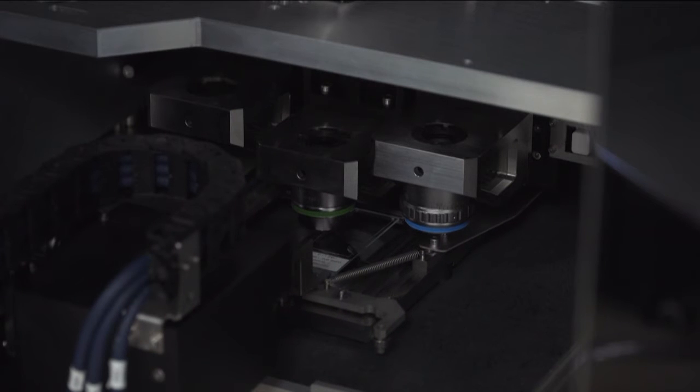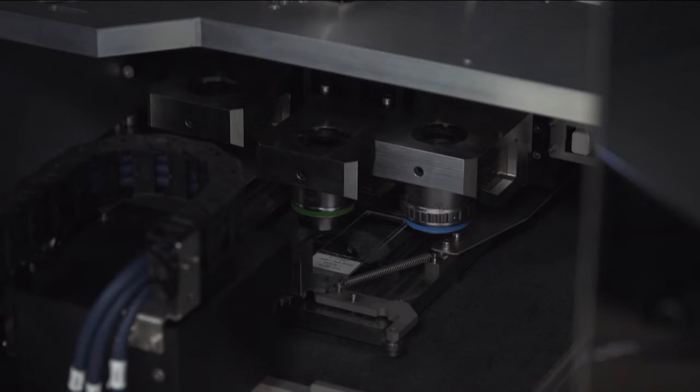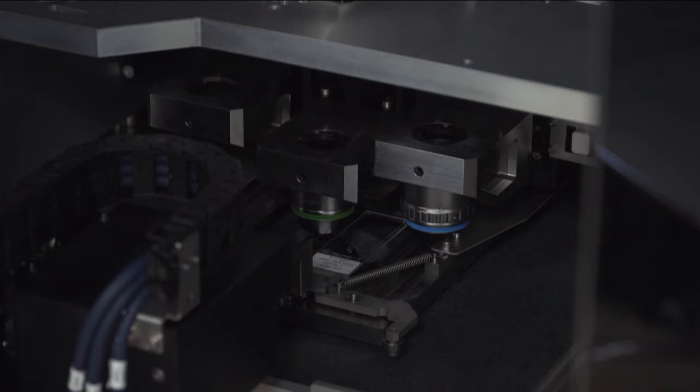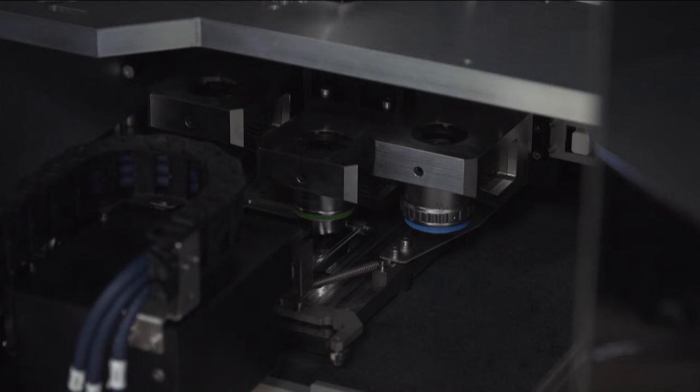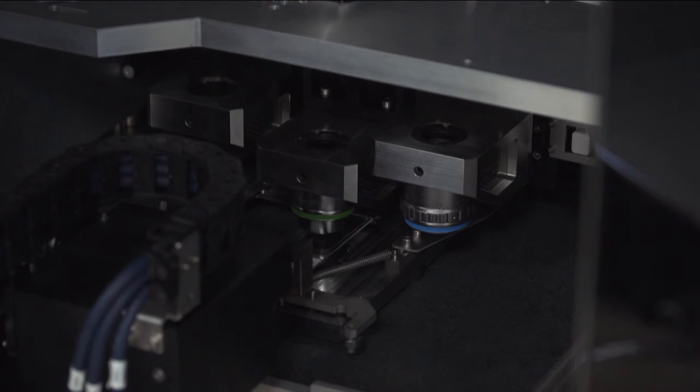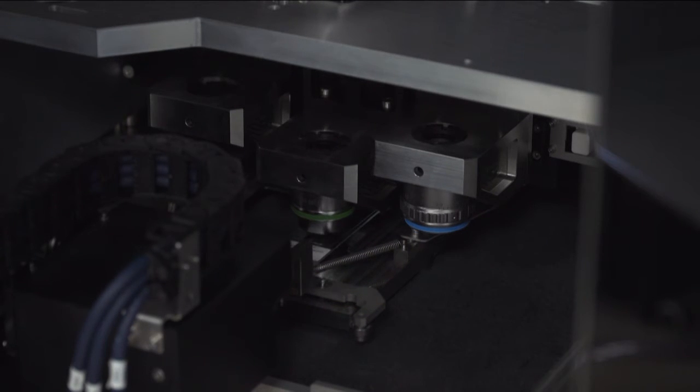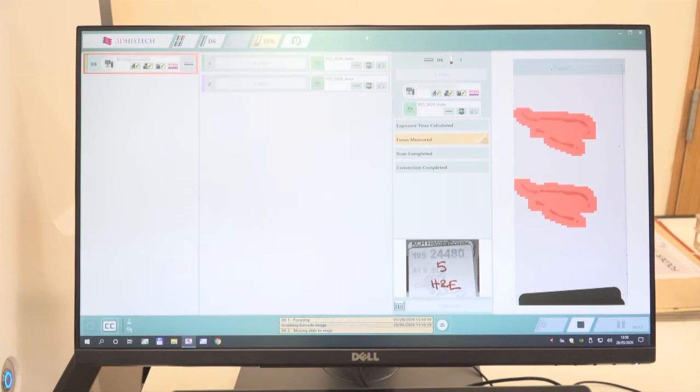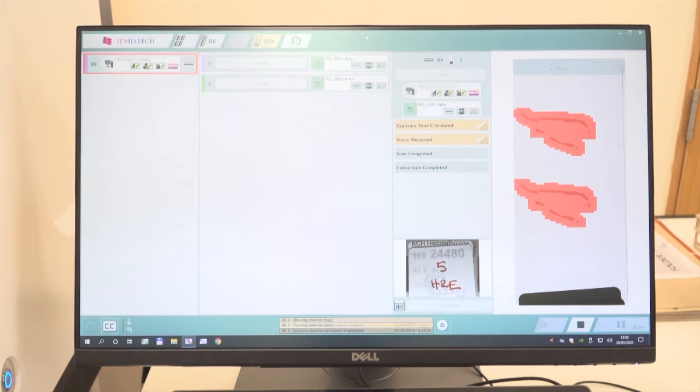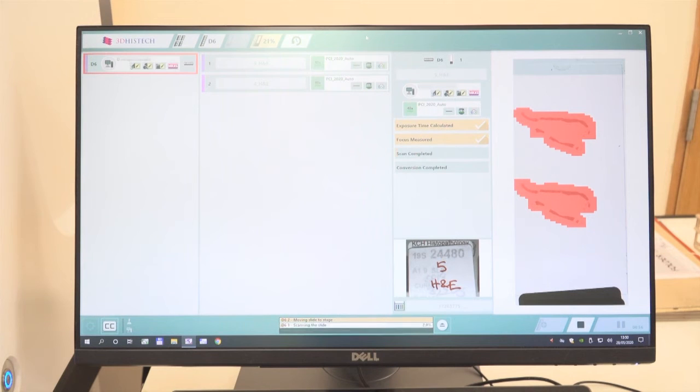In this case, it was put in the right-hand side position, and we used the 20 times objective to get the 40 times equivalent output. Currently, we're creating the focus map, and you can see the focus is measured, and we do an exposure time calculation.